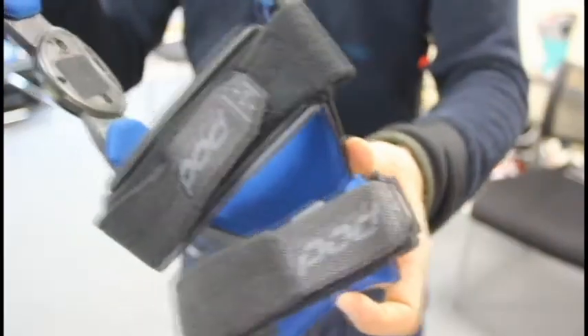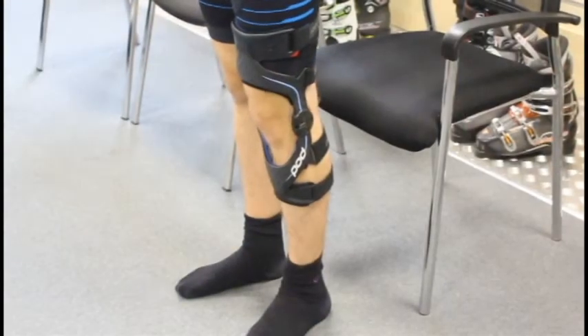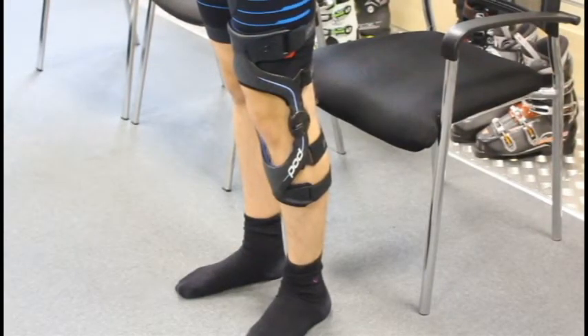Each strap has a number to indicate the order of fastening. Even though the carbon knee brace is there for structural support, it does allow knee flex.